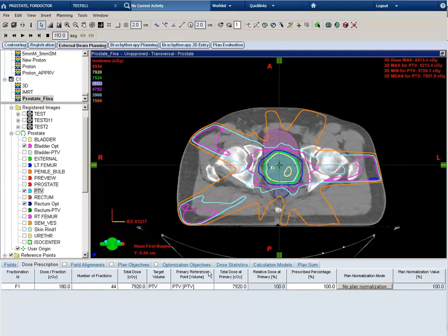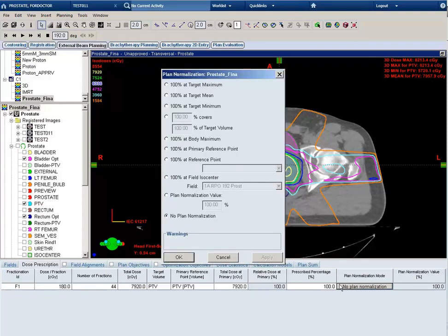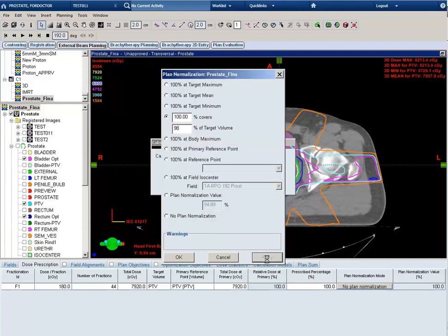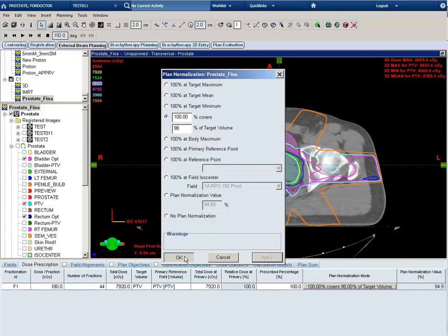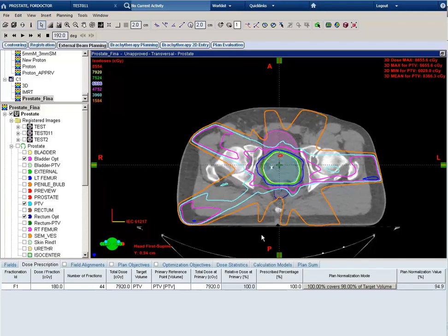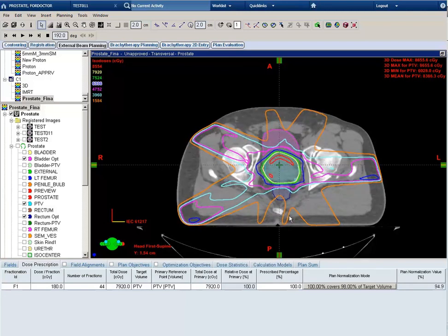Let's look at our isodose distribution from our first optimization. First we'll want to go to plan normalization and change our normalization constraints. I'm going to select 100% of the dose to cover 98% of the target volume. I'll hit apply and then OK.